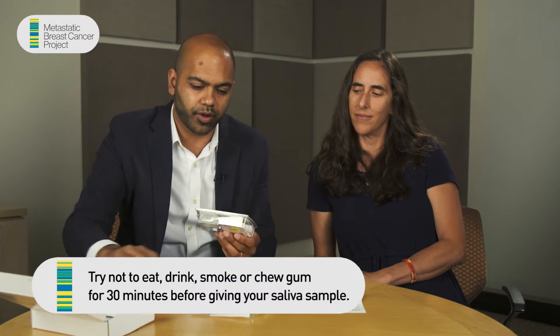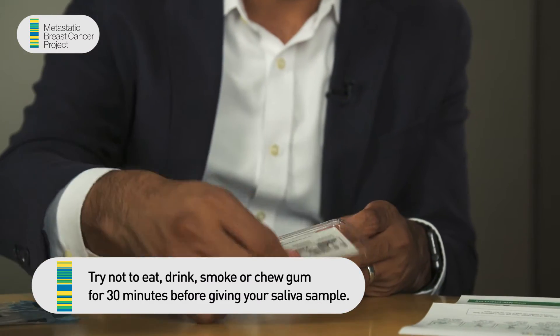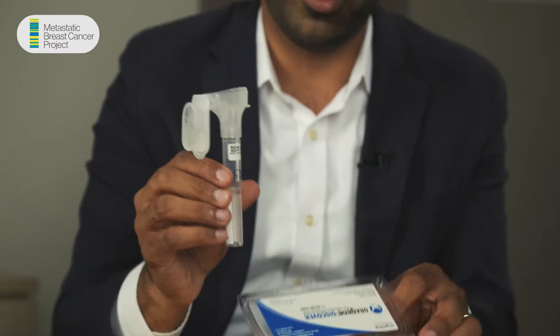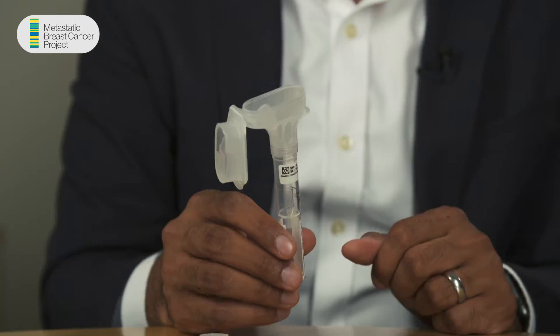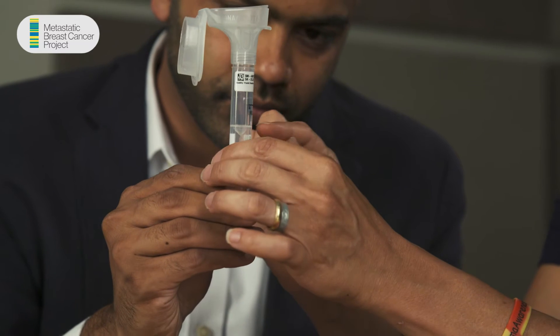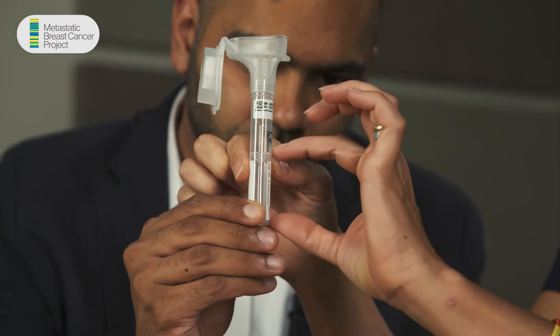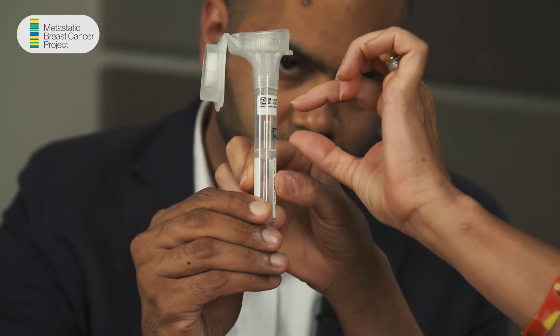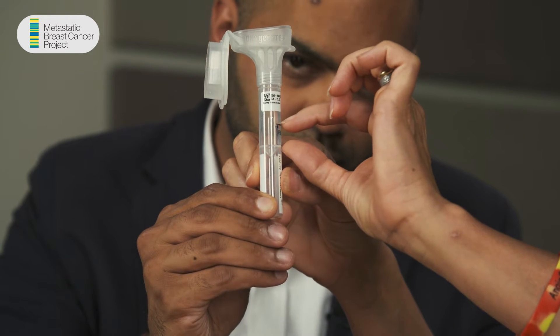Also inside the box is this bag and the kit itself. I'm going to open up the kit, and inside you'll find this funnel. Step one says to spit until the amount of saliva reaches the fill line. Do I have to fill up this whole thing? No — see right here is the bottom of the actual tube. It's very long so that it can fit onto a machine, but the actual part you're spitting into is only from here to this fill line right here.